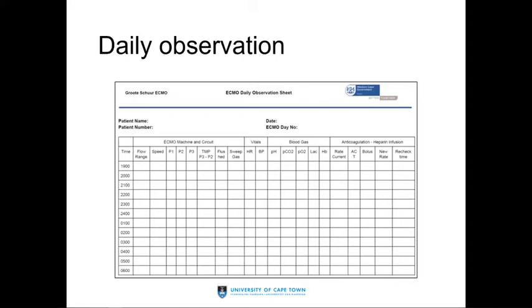In COVID patients, we have been targeting a higher ACT of around 220, which was what everyone used to target when ECMO first started, when you were more paranoid about oxygenators clotting than you were about bleeding risks. Our current patient on ECMO has got bleeding tendencies, so we're deliberately targeting 160 to 180 in him.